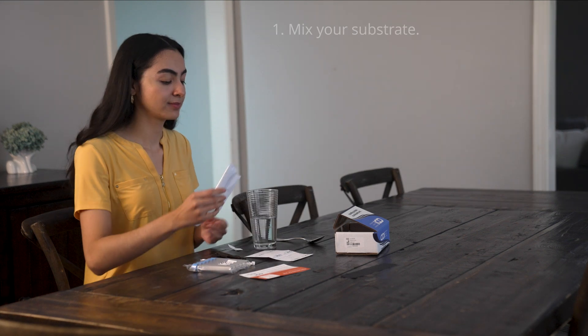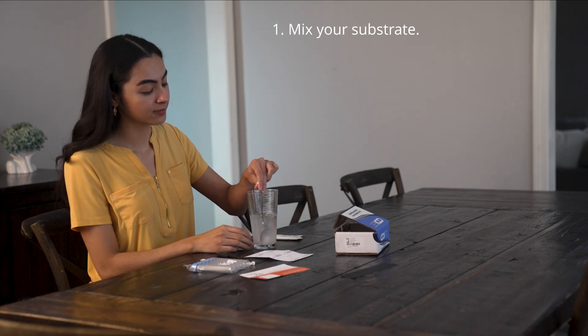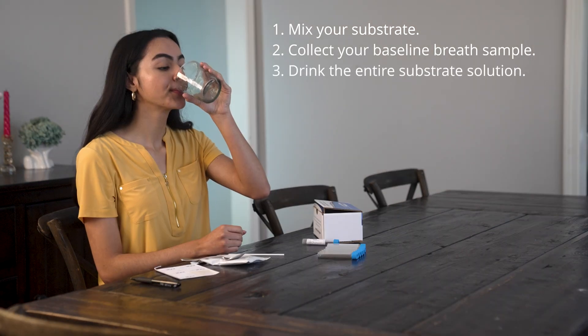Be sure to fill out and include the requisition form and other required information when you return your kit. On test day, after fasting, mix the substrate with water, but don't drink it yet. Collect your first breath sample to establish a baseline, label your sample, and then drink the entire substrate mixture.